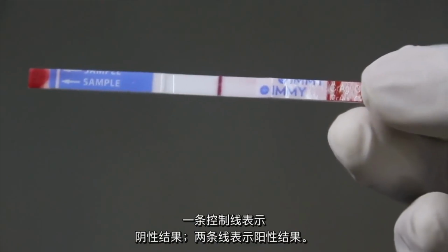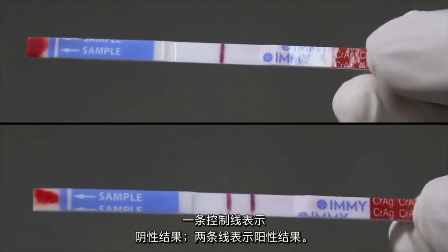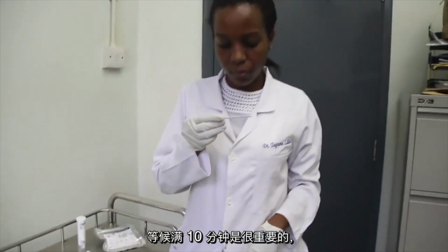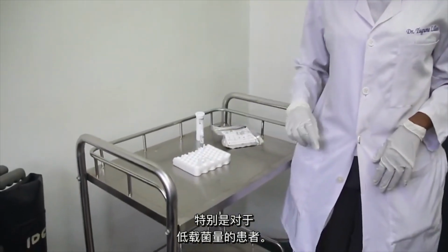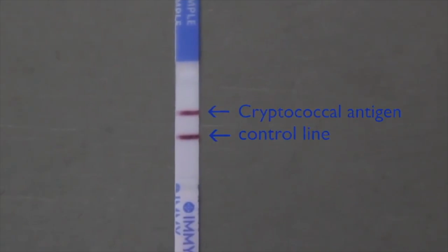1 line for control means negative. 2 lines mean positive. Make sure the control line is visible, otherwise the test is not valid. It is important to wait the full 10 minutes because results are not always immediately clear, especially in patients with low fungal burden. However, once 2 lines are visible, it is positive.